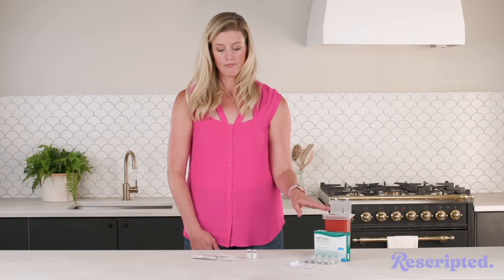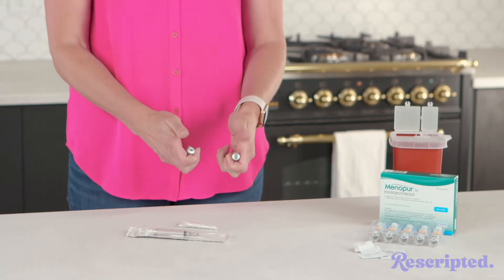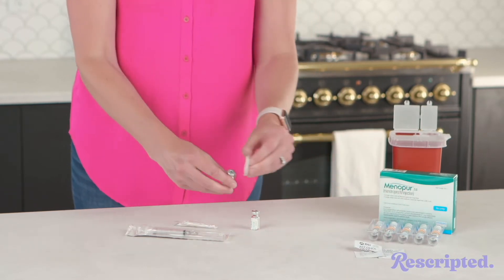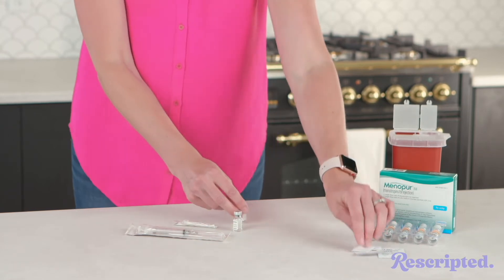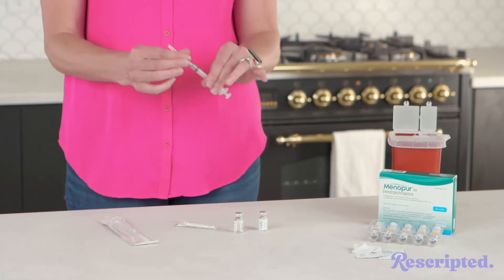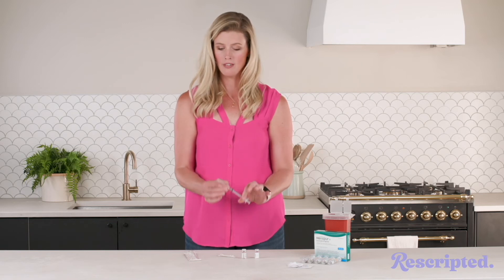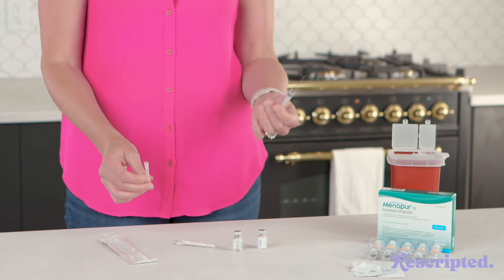The first thing you're going to do is pop off each of these vials — they each have a little cap on it, you're going to pop them off. Then you're going to use your alcohol swab and wipe off the top of each one. Next, you're going to open your syringe and make sure that the needle is screwed on pretty tight, because otherwise the med will go everywhere — that's an expensive mistake. Take the lid off of that needle.